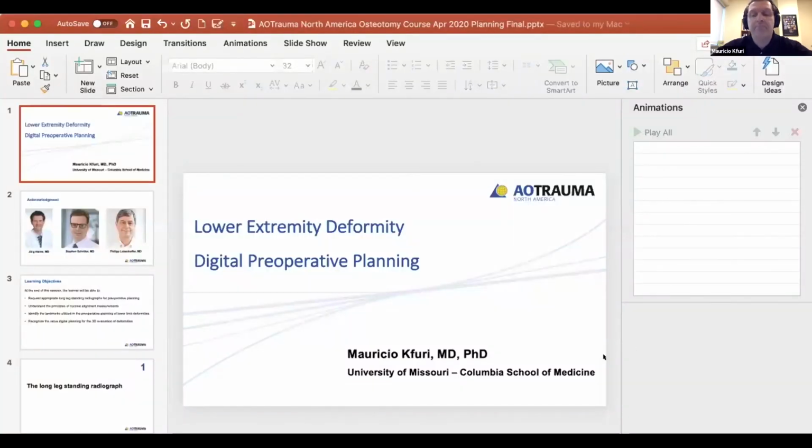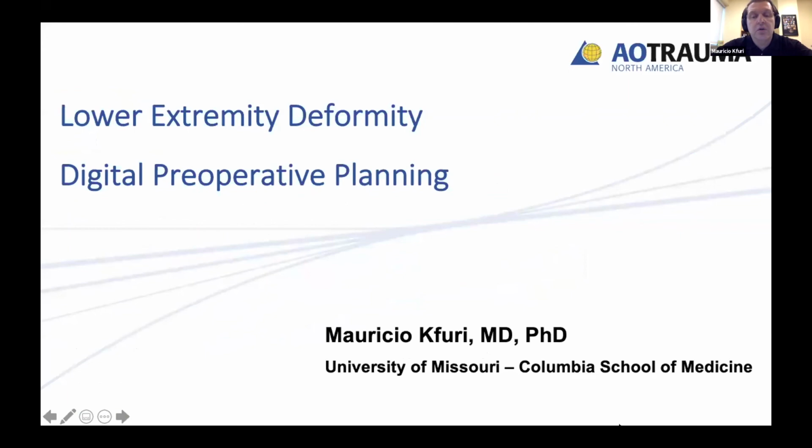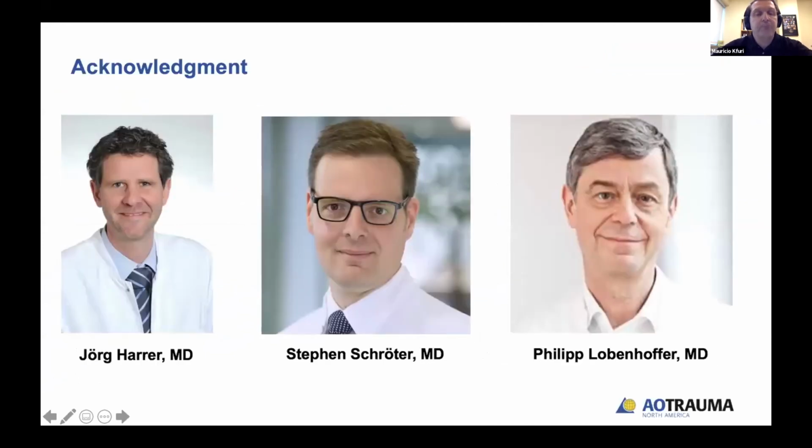So good morning, everyone. We're going to talk about digital planning, preoperative planning. Thank you very much for having me today. So basically, I'm going to share with you some of my experiences using one particular platform for preoperative planning.